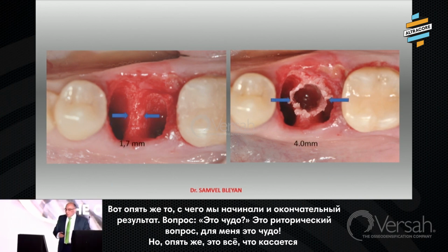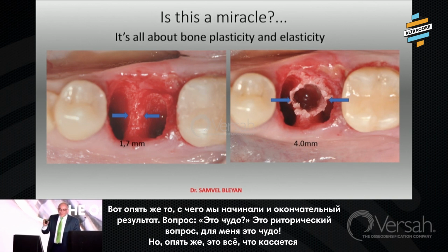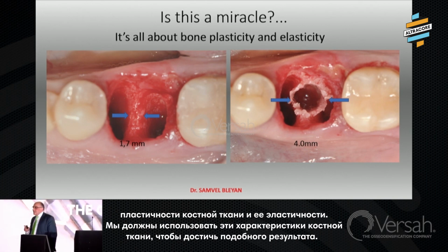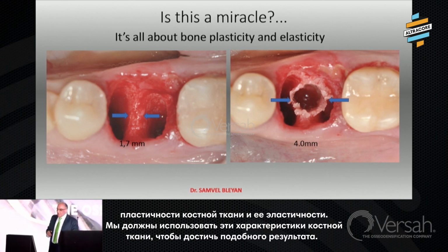Okay, this is initial and final result. Is this a miracle? This is a rhetorical question. It's a miracle for me. But it's all about bone plasticity and elasticity. We have to utilize all these characteristics of the bone to get such a result.